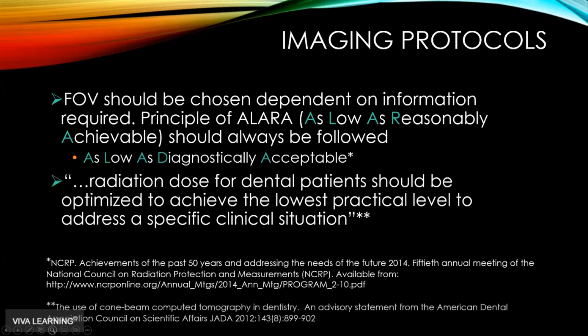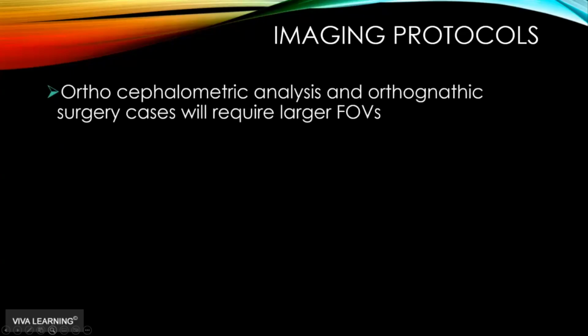And then this next comment is from the advisory statement from the ADA, which came out in about 2012. And again, another very, very common sense statement. Radiation dose for dental patients should be optimized to achieve the lowest practical level to address a specific clinical situation. So with imaging protocols, if you're an orthodontist and you want to do a cephalometric analysis, or you're doing orthognathic surgery, you're going to require a large field of view. You absolutely need all the points.